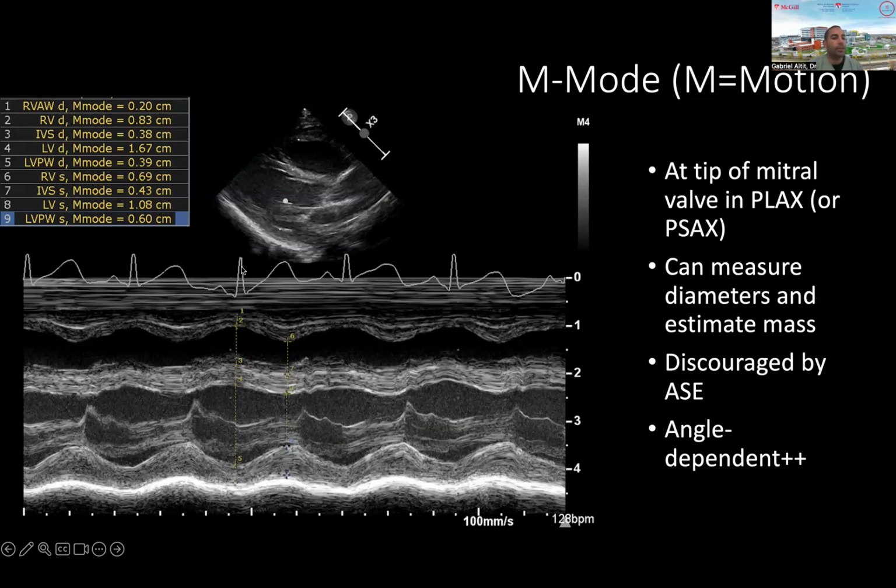So I know this is diastole because it's just at the QRS or before the QRS. And so at QRS, you're going to get activation of your ventricle and eventually you get contraction. And so you see that this septum will get nearer to the posterior wall of the LV and you get thickening of your left ventricle. So you use these different measurements, first of all, to measure your LV end diastolic diameter, which provides you information of whether or not your LV is dilated. So some markers of PDA significance will be based on LV end diastolic diameter. So you can get a Z-score. If your Z-score is more than 2, you know you have dilatation of your LV.